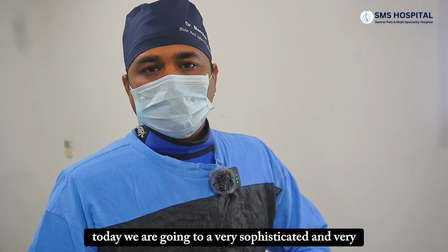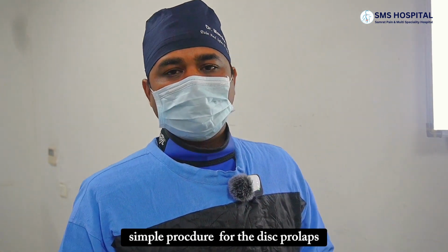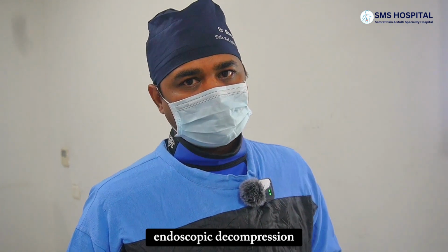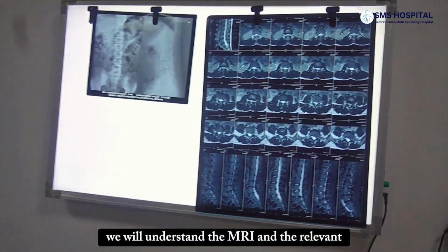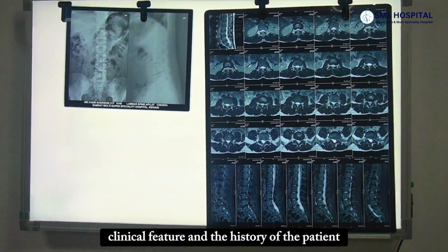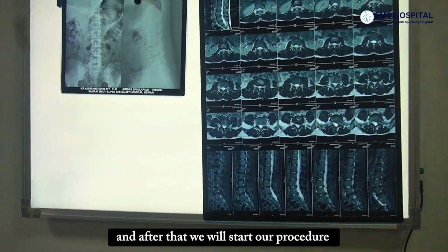Today we are going to do a very sophisticated and very simple procedure for the disc prolapse, which is percutaneous transforaminal endoscopic decompression. First of all, we will understand the MRI and relevant clinical features and the history of the patient, and after that we will start our procedure.